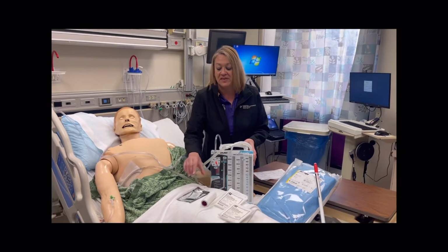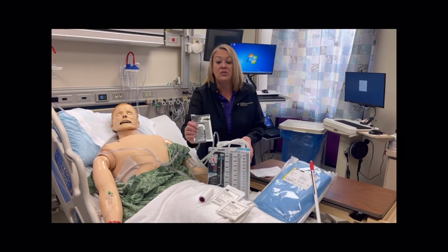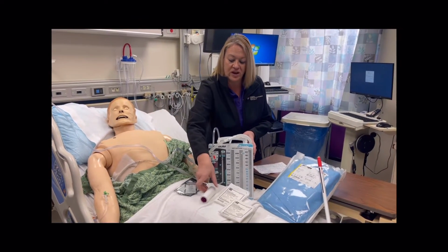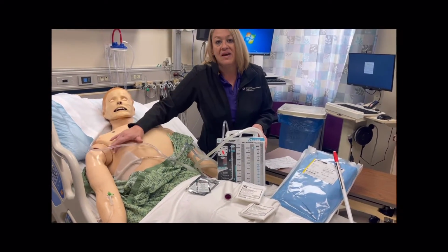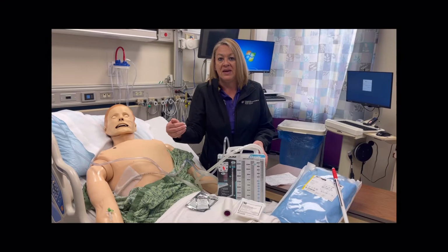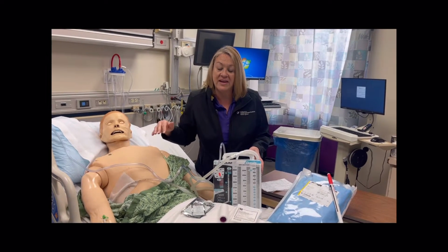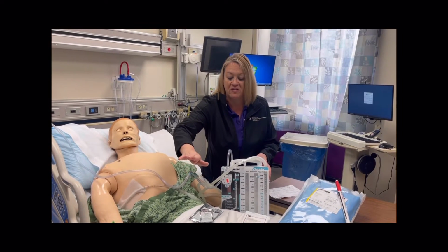That's why we keep dressing supplies at the bedside, which is going to include Vaseline, petrolatum, Xeroform, an occlusive petrolatum embedded dressing. This will help stick to the wall and help prevent air from being pulled in that hole in their chest. You also need 4x4s, and you need Medi-Fix tape. You need to create a 3-sided dressing, only 3 sides, not the 4th side. That allows when the patient breathes in, the chest dressing will collapse against the chest wall and prevent further air from being pulled into the chest. And as they're exhaling, that 4th open area allows the air to come back out like a flap valve.